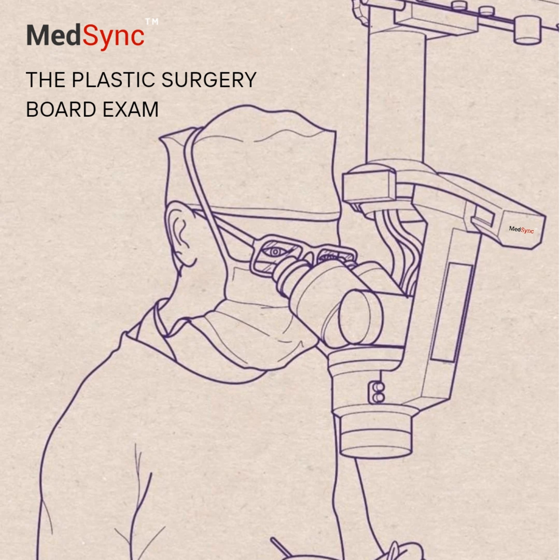Are there any gray areas? Can you ever cautiously use it near exposed structures? Very cautiously, on a case-by-case basis. Maybe using the white foam or extra non-adherent layers as protection with close monitoring, but the default is avoidance, high risk. Understood. So what are our main treatment goals when we decide to use NPWT?